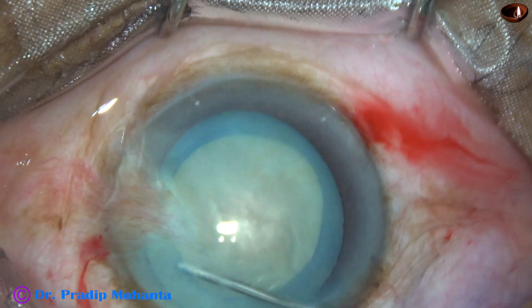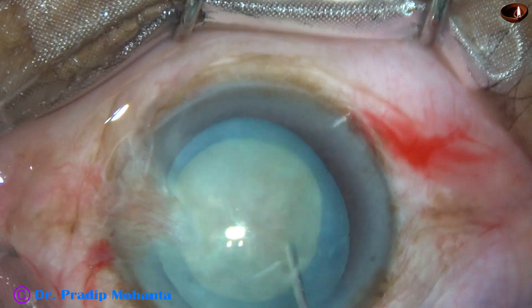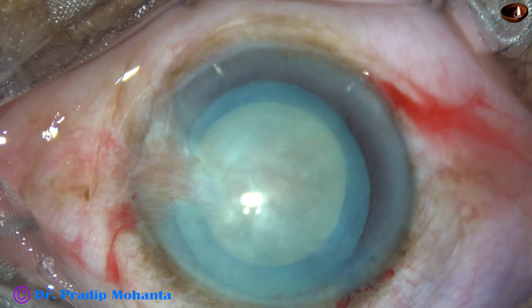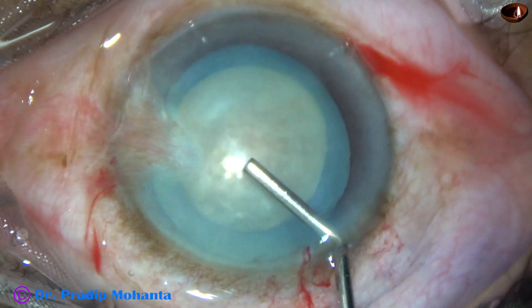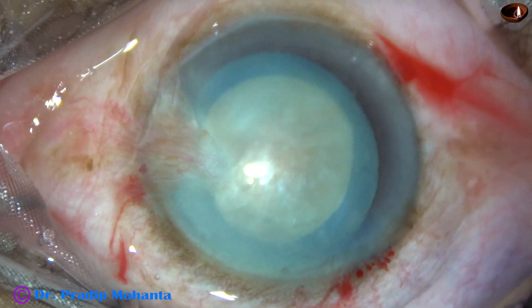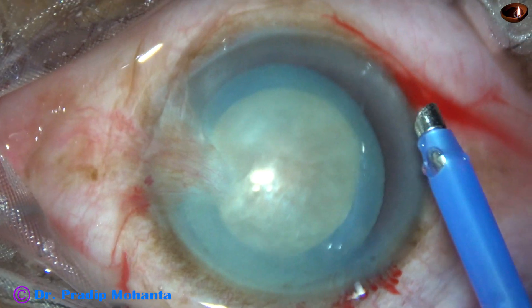Very little hydrodissection was done and the nucleus rotated. And now viscoelastic is again injected. And now it's time to introduce the phaco needle inside the anterior chamber.